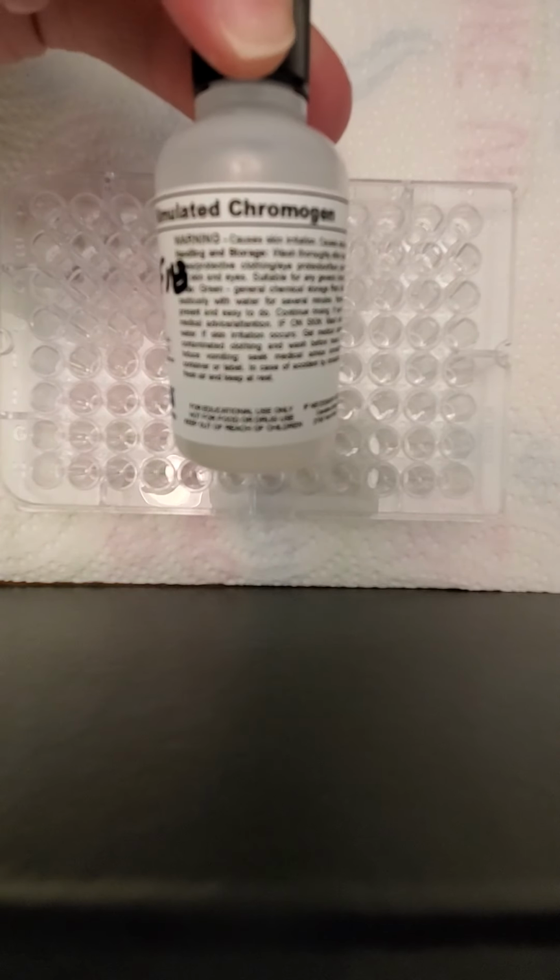And then lastly, the very last thing that we're going to do is, now that that secondary antibody is sitting in there trying to find that antibody in the patient if it's there, we need to facilitate that color change, and that's what happens with this chromogen. So we're going to add 3 drops using a new pipette to each well in rows A through B, and we should start seeing color changes if those antibodies are actually present in that patient's serum.